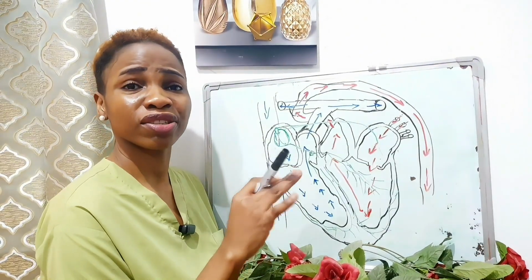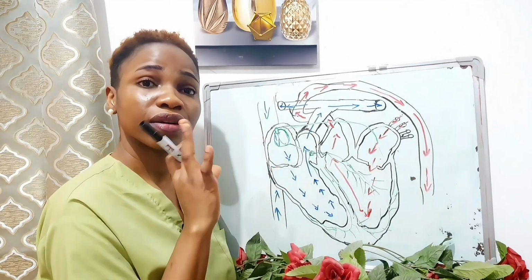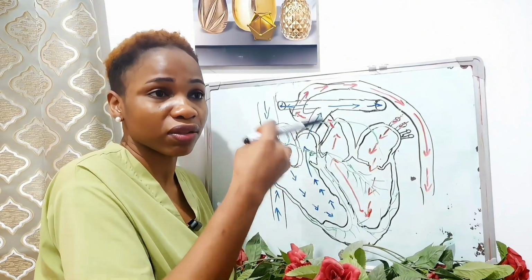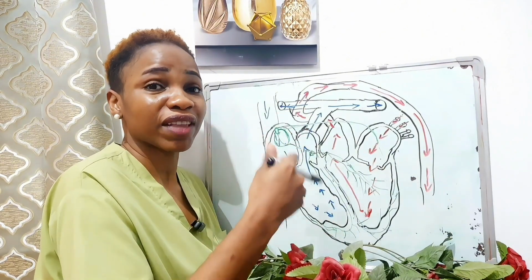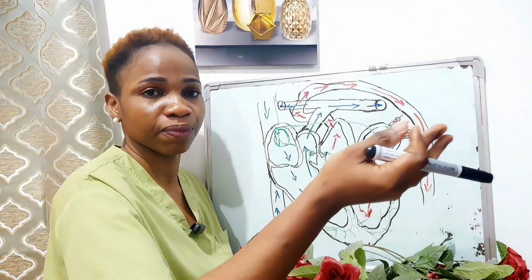Just know that the electrical activity of the heart involves three steps: atrial contraction, followed by ventricular contraction, and followed by ventricular relaxation. Each cycle makes up these three steps. After the ventricular relaxation, which is the third step, another cycle will start again.